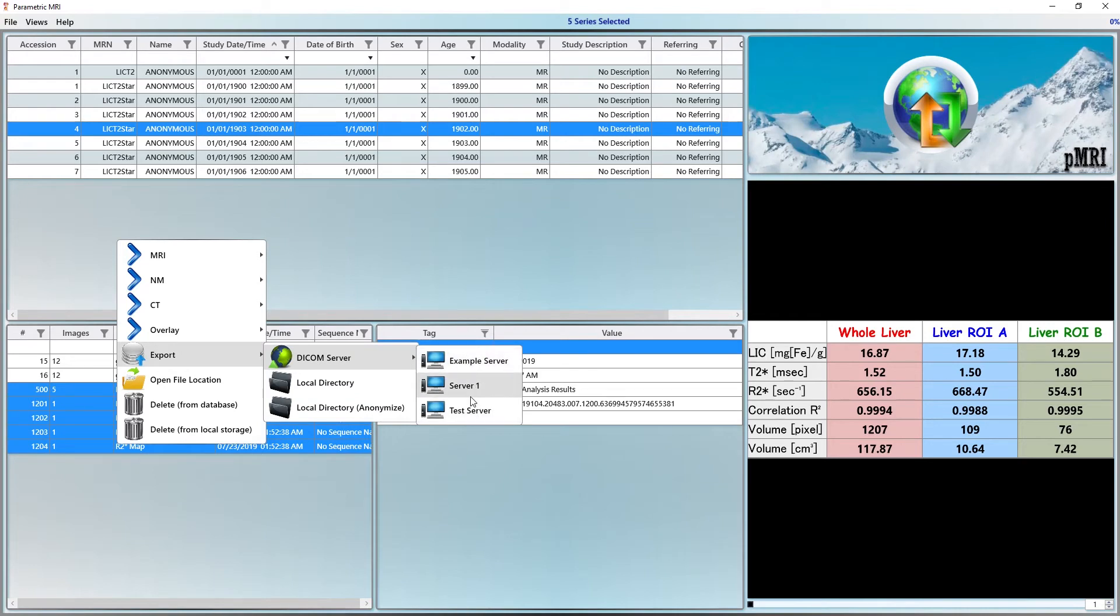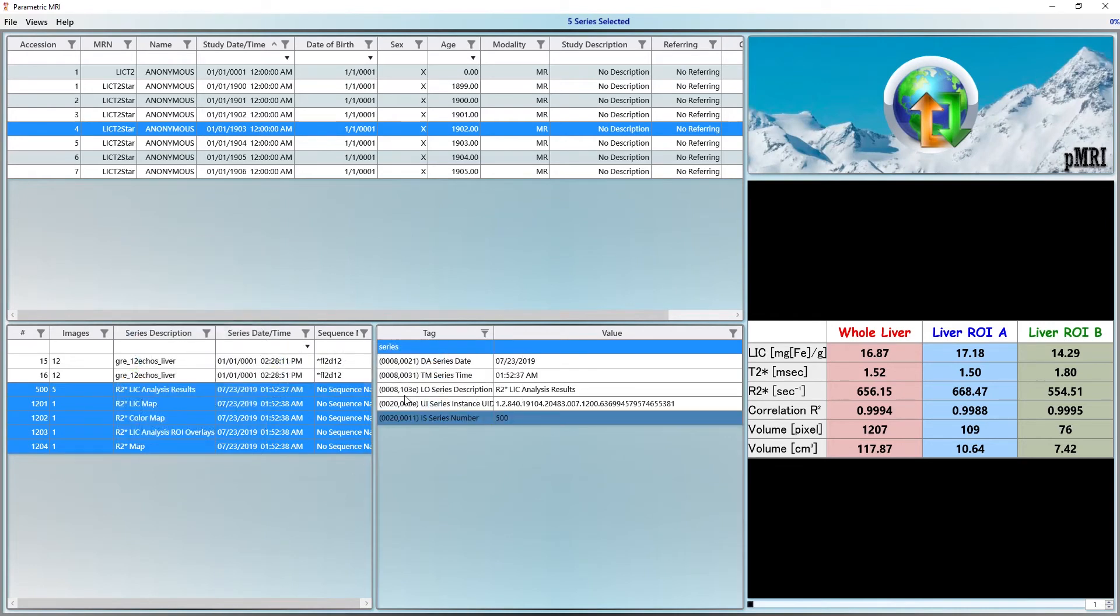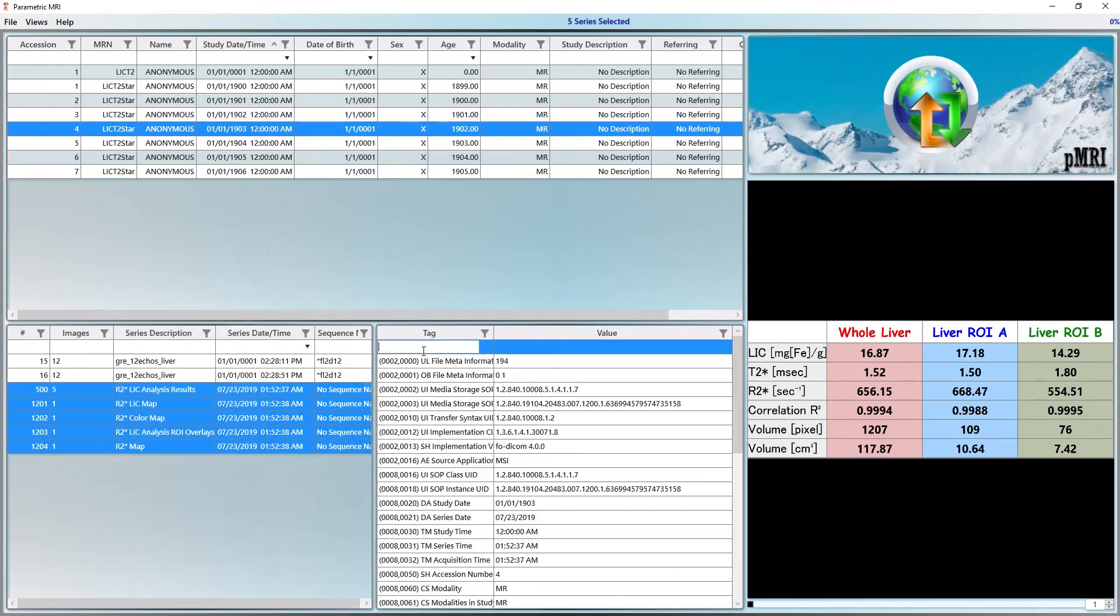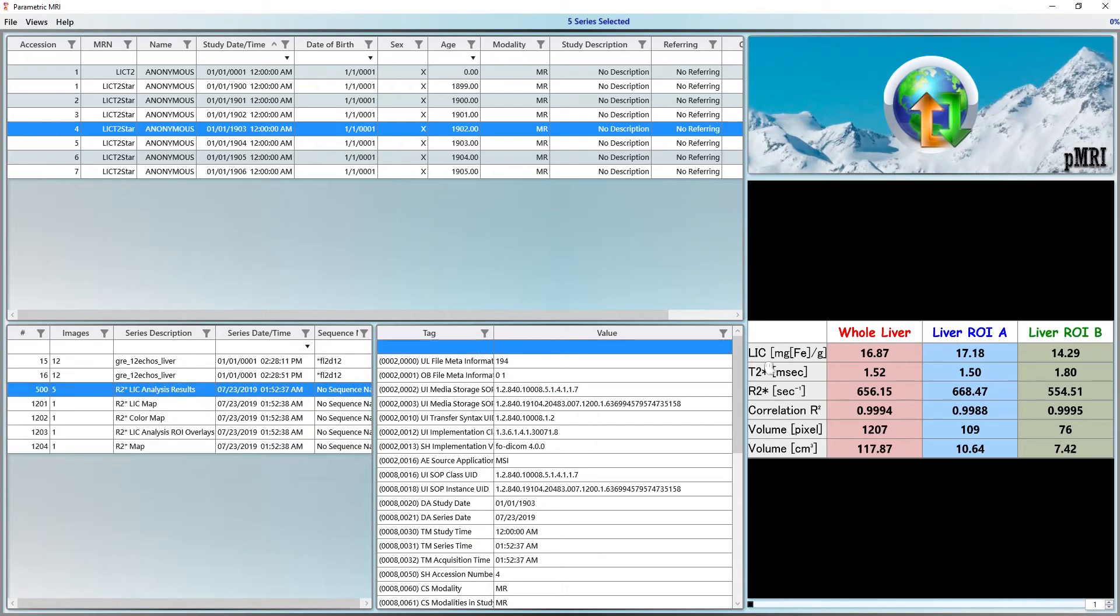Even though we are done with the analysis, let's take a closer look at the results. The first series has tabulated values and various plots including an LIC history chart for this patient.